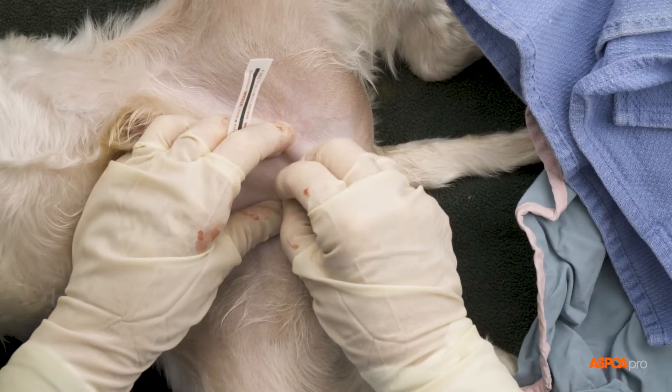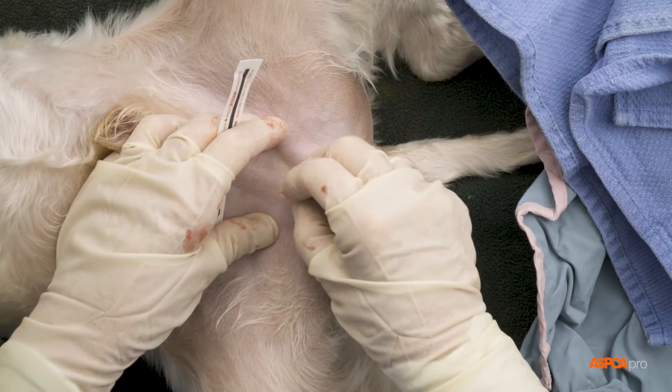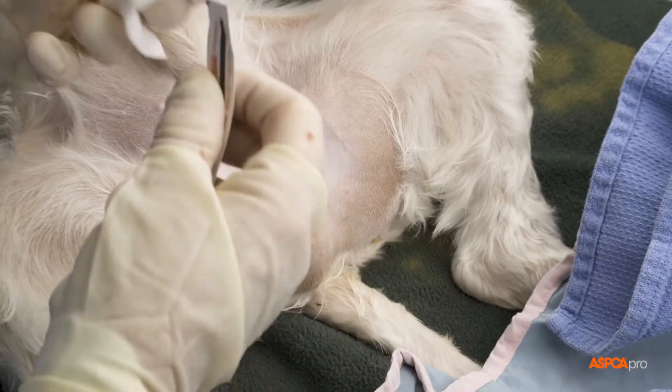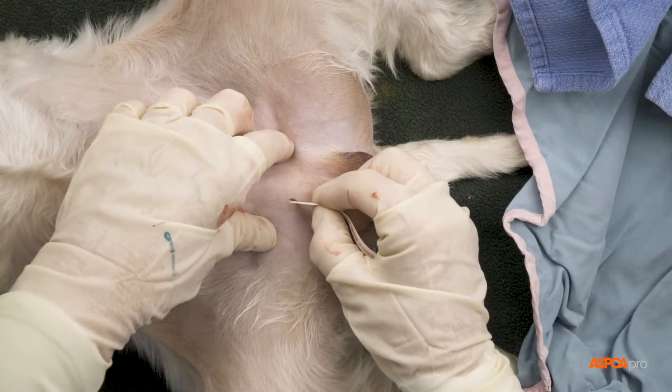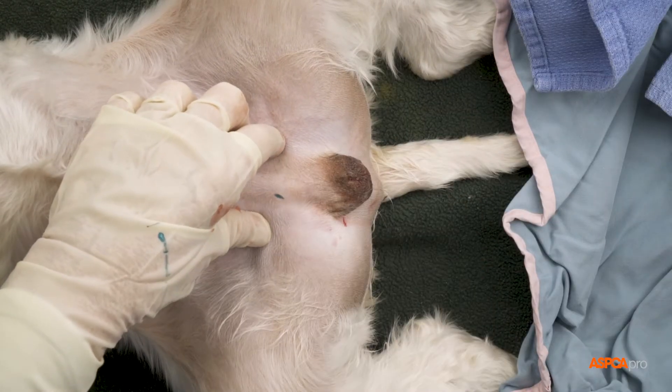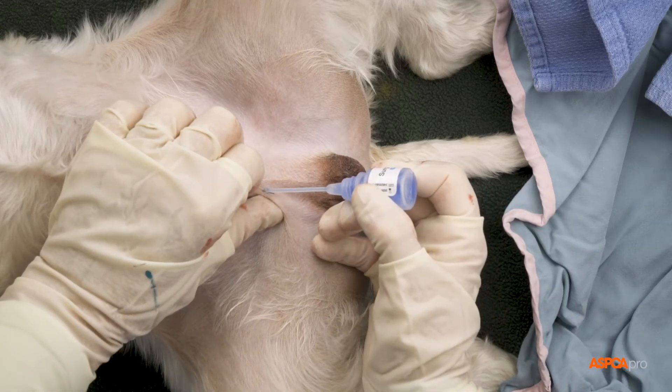Finally, as with all of our surgeries, we place a small green tattoo to indicate that the dog has been sterilized. Here, we place it just in front of the scrotum. We then seal the tattoo with surgical glue.